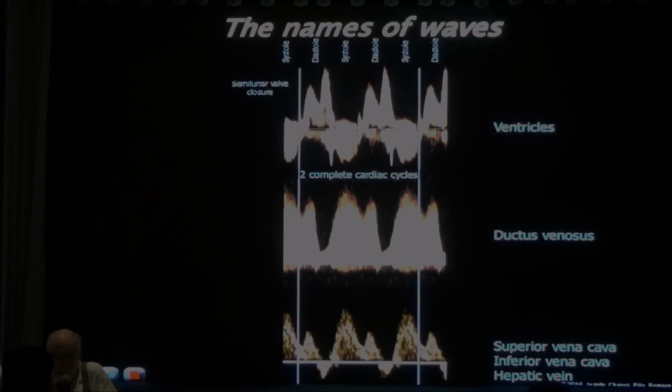So the heart pressure is decreasing, but not enough yet for the AV valve to open. So this is isovolumic relaxation time. And on the opposite side, you have the AV valve that has closed, but the pressure is not high enough to overcome the pressure in the aorta, and this is the isovolumic contraction time.